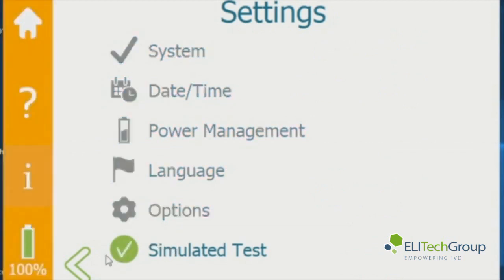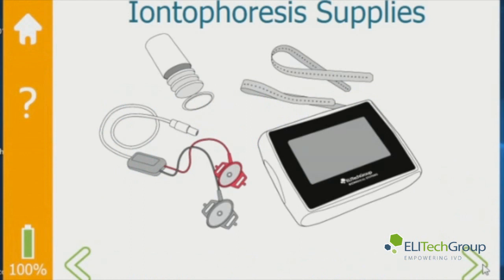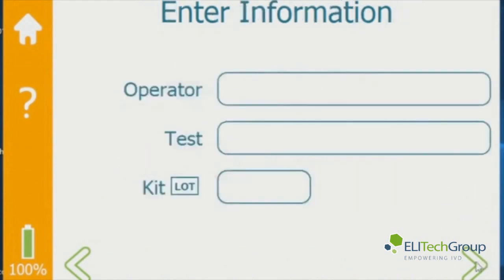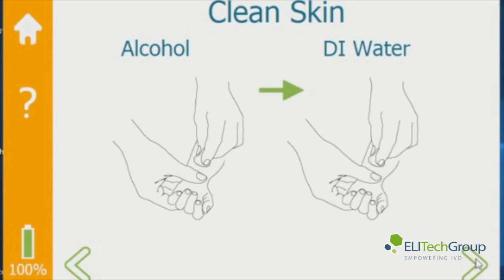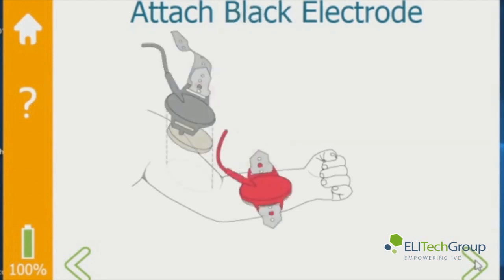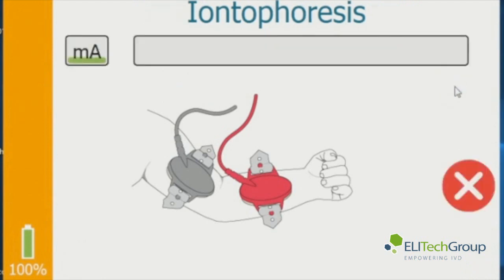There's a simulated test which you can run and it will walk you through a complete test. Hit the forward button — it shows you the iontophoresis supplies required. You can enter an operator and test name, then choose the limb you're going to test. Clean that limb with alcohol and then DI water, attach the red electrode closest to the wrist where there is the highest concentration of sweat glands, put the black electrode on with gels attached, then hit the forward button and it starts the test. The iontophoresis runs for 300 seconds — 5 minutes — and then it will shut down.